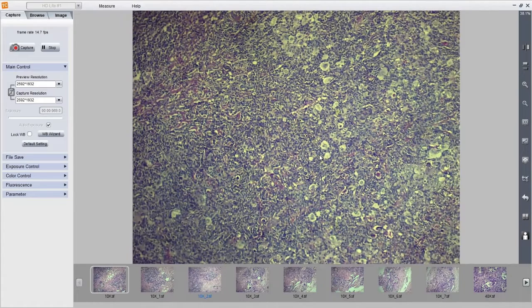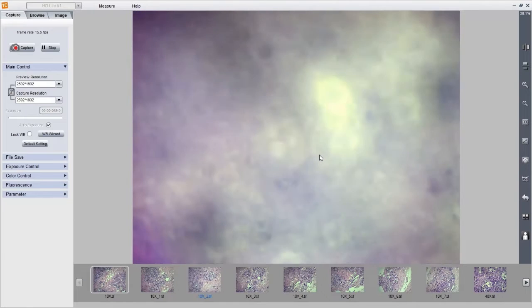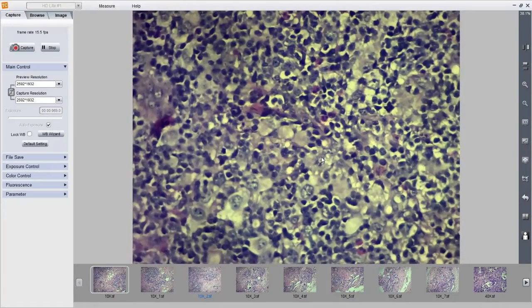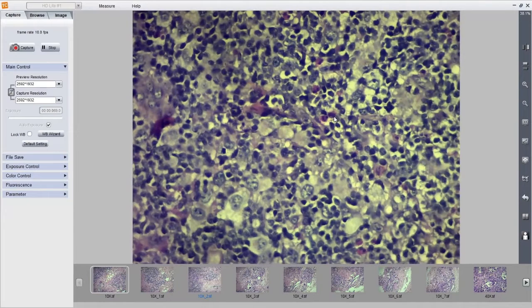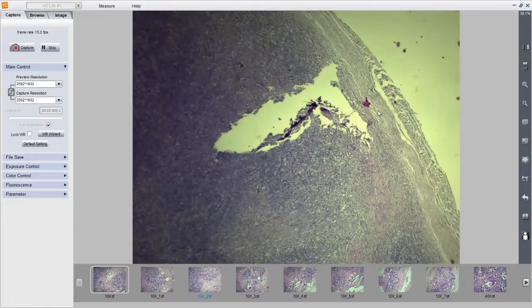Shall we go a little bit more onto the higher power, 40x? Okay, so these were the large cells that we were seeing, the lacunar cells. This is the 40x. Then we are seeing eosinophils in the background, and the small cells are small lymphoid cells. The background is reactive. I don't see any atypia in the background. I see these large lacunar cells scattered here. My morphological diagnosis is nodular sclerosis Hodgkin lymphoma as of now.